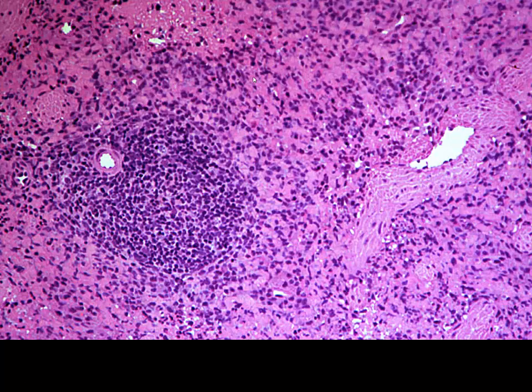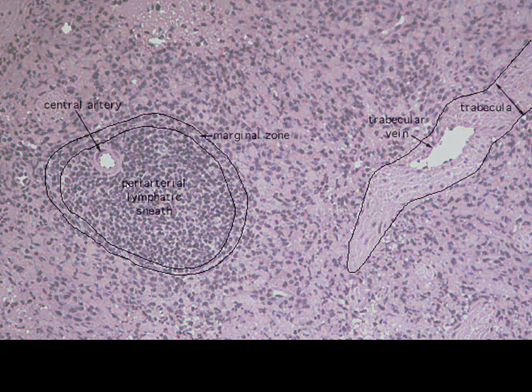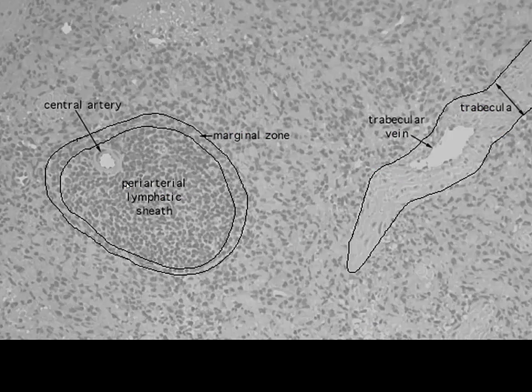And there's our higher magnification looking at that central arteriole in this case. We've got our secondary lymph nodule here, our PALS, the area just immediately around. This is a fairly small one, so we could theoretically include this whole thing, but I still like the cells immediately around that arteriole to be considered our PALS. See, they do the whole thing. I think that's a bit much based on what I've seen in other literature and textbooks.